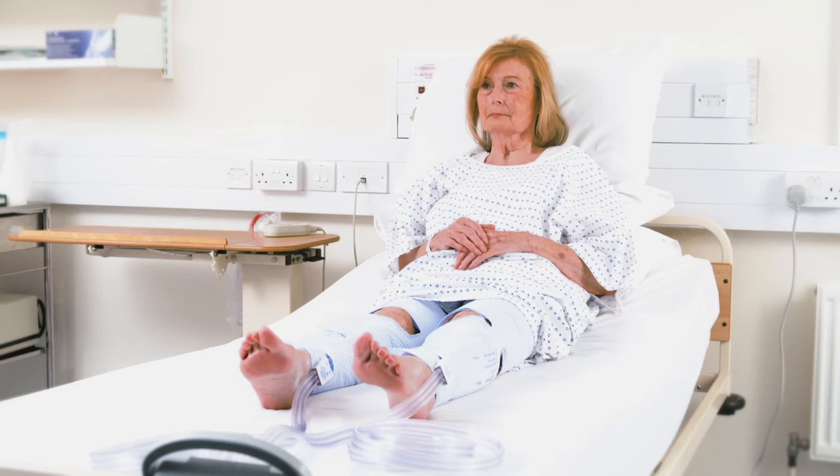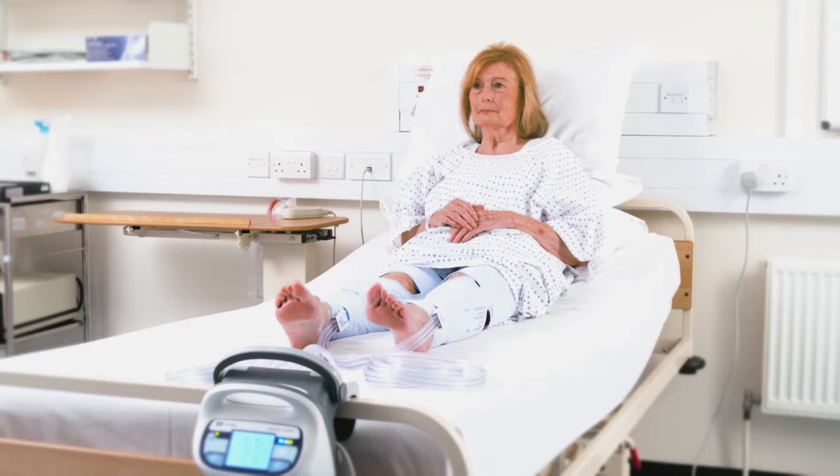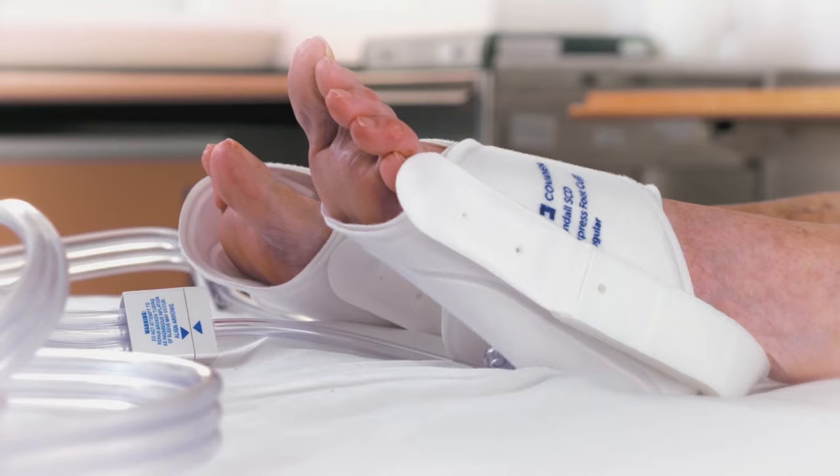Press the power on or standby button to begin operation. If using leg sleeves, no further intervention is required as the controller will automatically detect whether a knee length or thigh length sleeve is being used and then begin to deliver the set pressure pattern of 45, 40, 30 mmHg pressure.